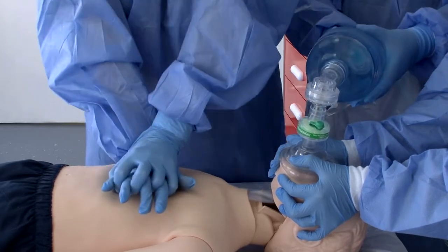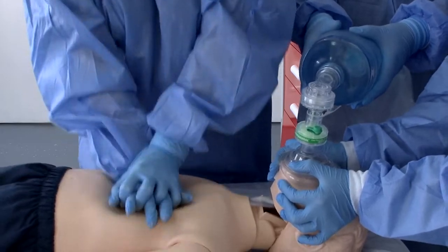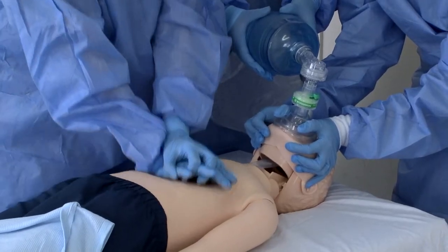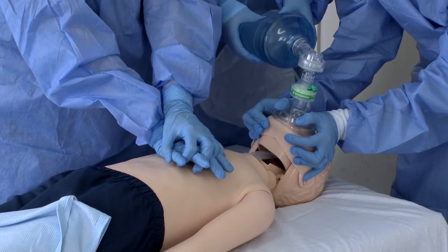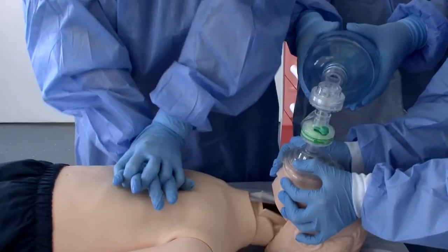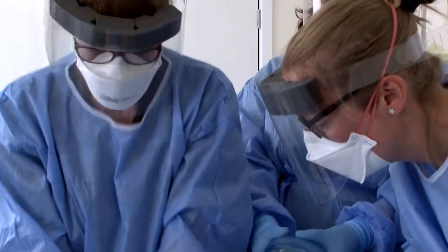It is important to change the person doing chest compressions at least every 2 minutes to avoid fatigue. Having established effective CPR, the defibrillation pads should be attached to the child in order to assess the rhythm. The paediatric ALS algorithm should then be followed as appropriate.